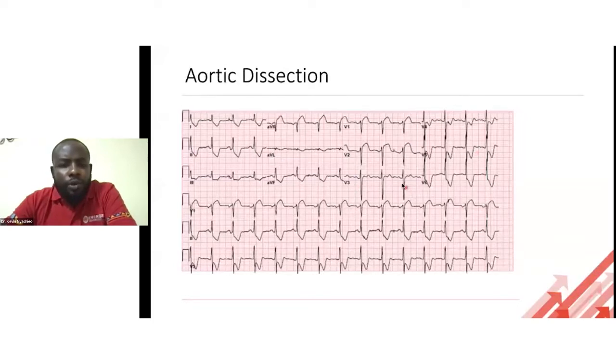Most commonly, in most aortic dissection, the most common feature on ECG is ST depressions, widespread ST depression. Usually, when you're doing ECG, you are more or less seeing complications of the dissection. Okay, so you're seeing an MI. Okay, common presentation on ECG is ST depressions. I think up to 30–40% is ST depression. ST elevations, not so much, could be up to 10%, but it's still there. Aortic dissection, okay? It's something to have at the back of your mind.